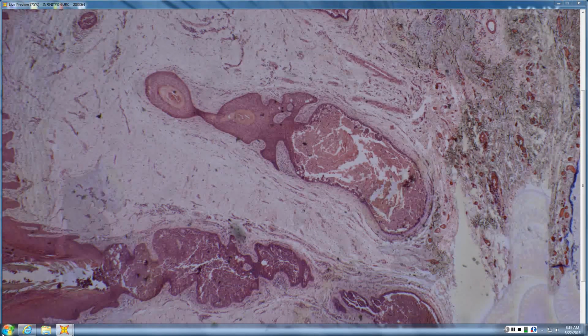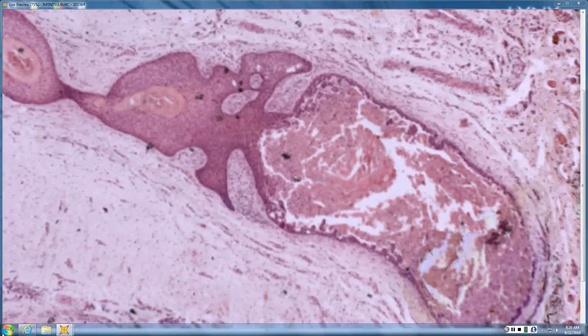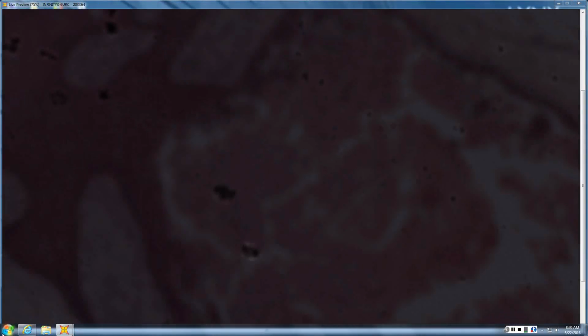It looks like it connects to the surface. We might be on acral skin, maybe. There are also some, I think, what look like infiltrative types of islands in there, or they might be blood vessels. I can't tell from this power. Okay. But I'm already in the nervous category. So already in the nervous box. And so we go higher, and it is a sweat gland tumor.